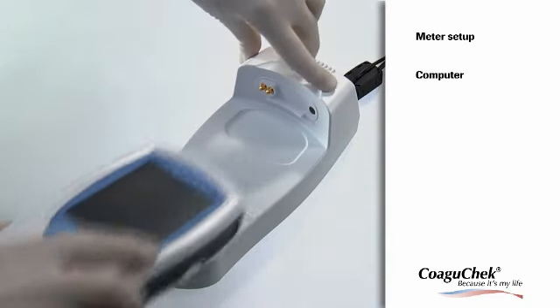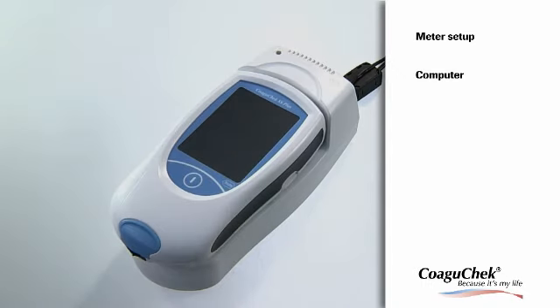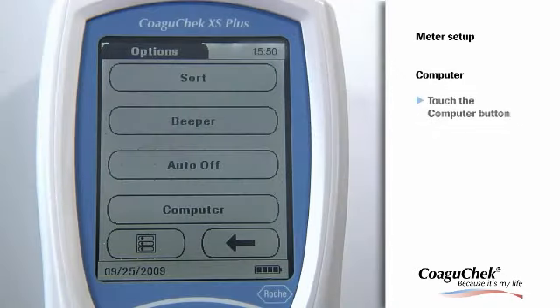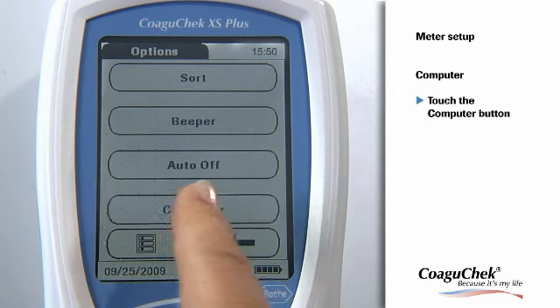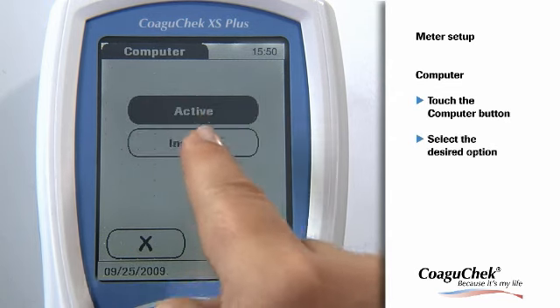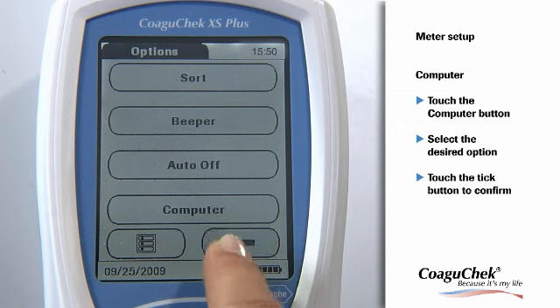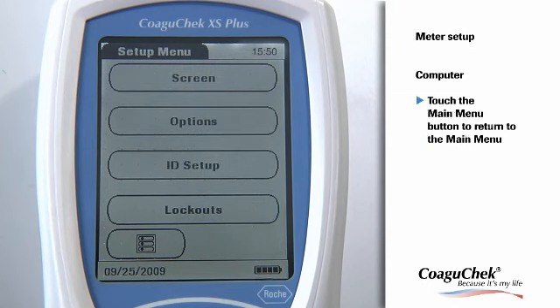Your Coagichek XS Plus meter can connect with a data management system via the handheld base unit. To activate this option, please touch the Computer button. Touch the button with the setting of choice, and confirm your setting by touching the Tick button. You get back to the Main Menu by touching the Main Menu button.